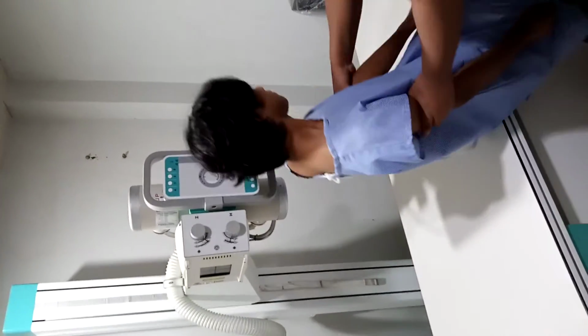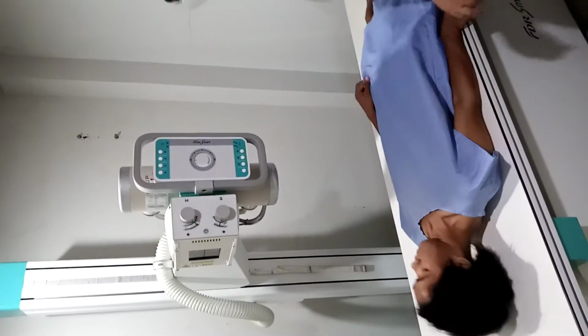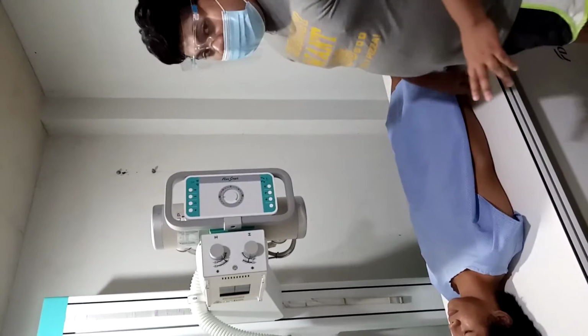In patient positioning, position the patient. It's either supine or standing upright. So today we're going to position the patient in a supine position. Then you must always remember to center the patient's body in the table.